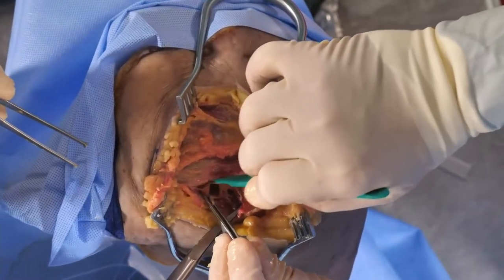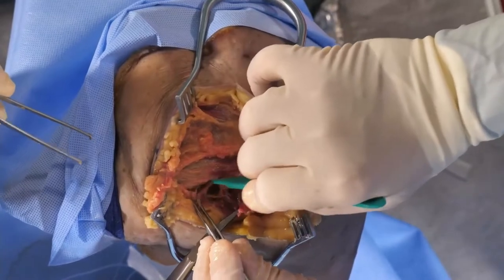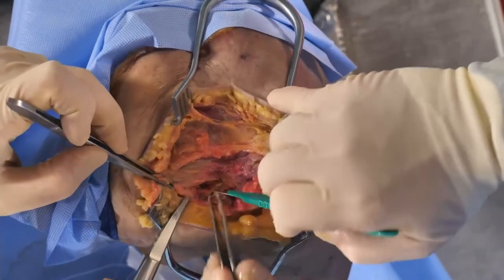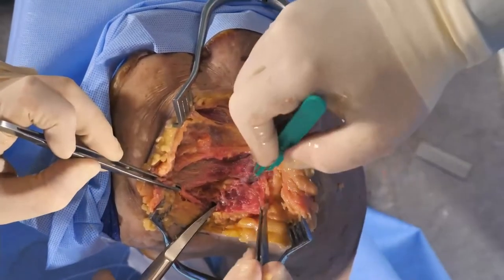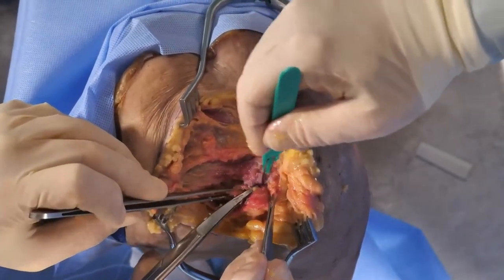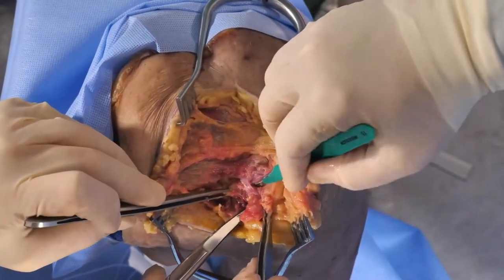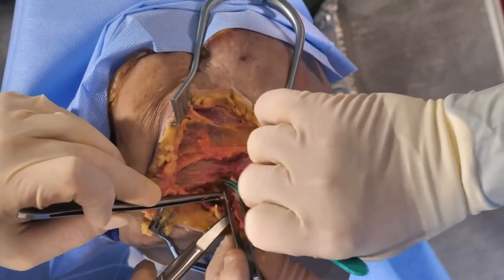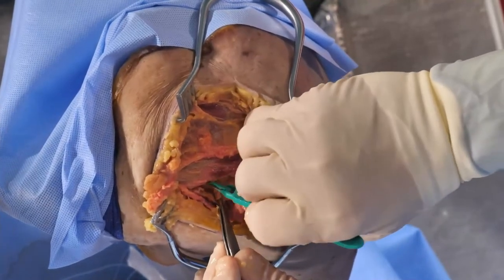This is what I was talking about before, where we have the anterior attachment of the deltoid on the clavicle, and then we come inferior here to try to get to our area. We always want to try to go inferior with this dissection. You'll see the AC joint is right here and we'll just try to take that all off as a sleeve to try to repair at the end.